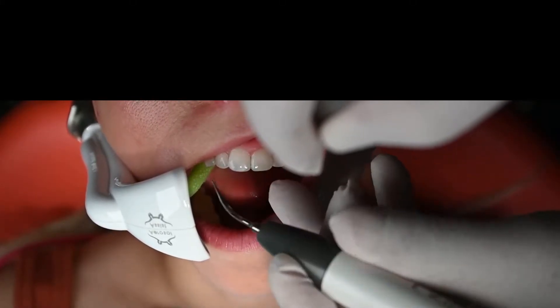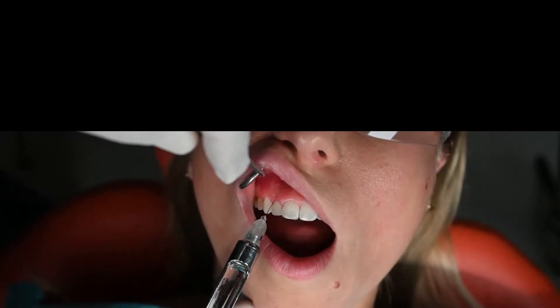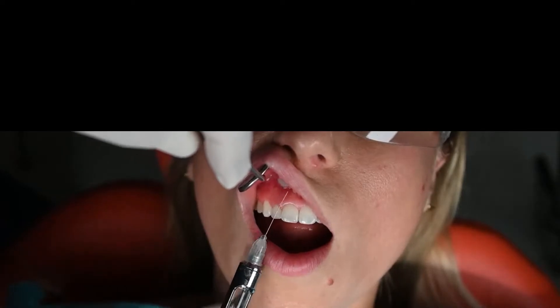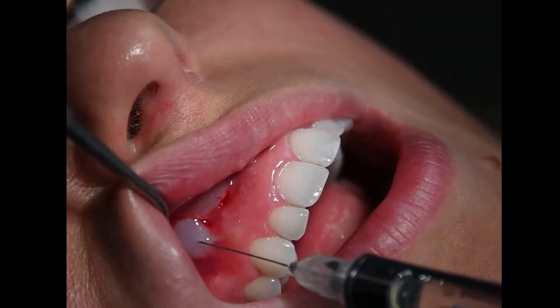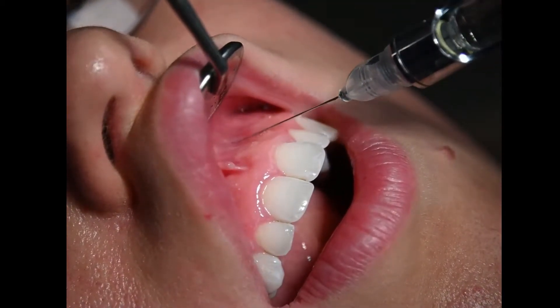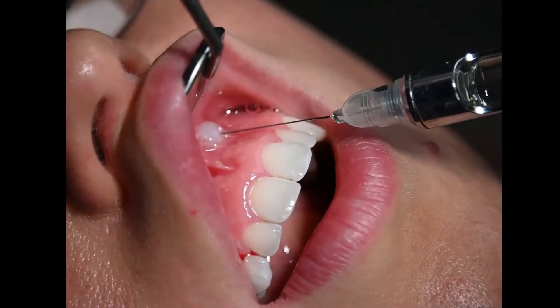Anesthesia is applied. Giving pain-free anesthesia for the maxillary can be predictable by air drying the injection site, then applying benzocaine for 20 seconds. Deposit slowly, and then once 25% of the carpule is given, move on to central number 8 and then the canine number 6. Bypassing the midline should be painless when injecting number 9, since adequate time has passed.